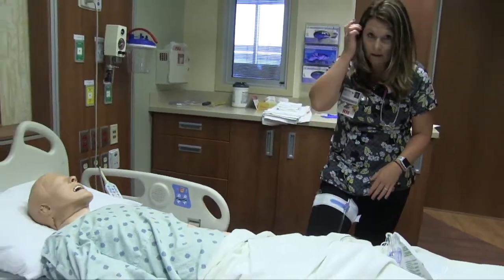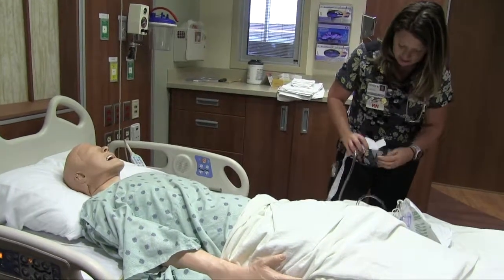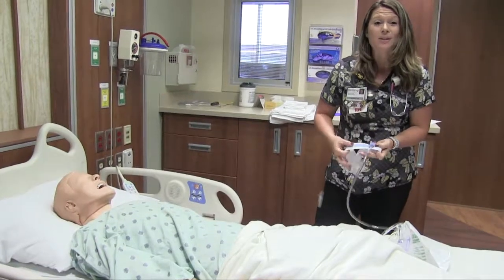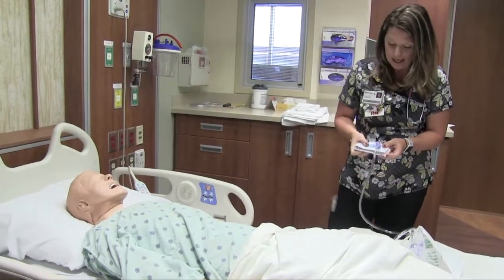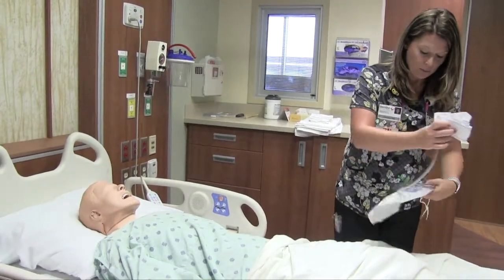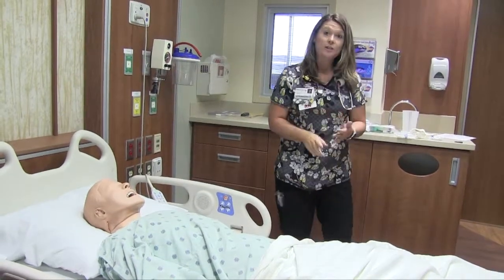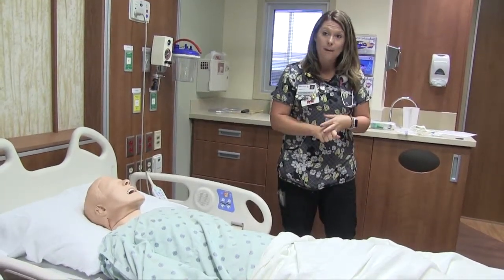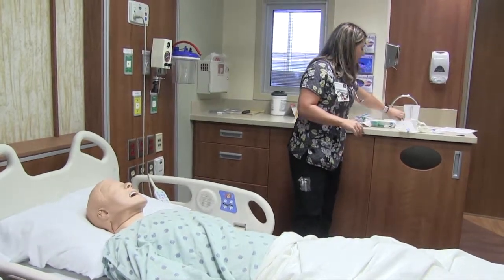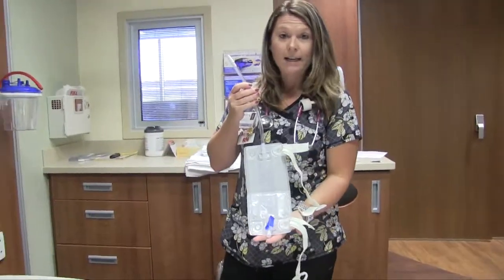You guys feel comfortable? Okay, so what I like to do for my patients is just take this off and leave it this way in your bag, so it's also just another refresher when you get home that this is how you will use this. Okay, so we'll put this bag aside. Again, this bag is used while we're sleeping, while our feet are above our waist, so that we have good drainage. Now, the other bag that we have is a leg bag, and that's this bag right here.